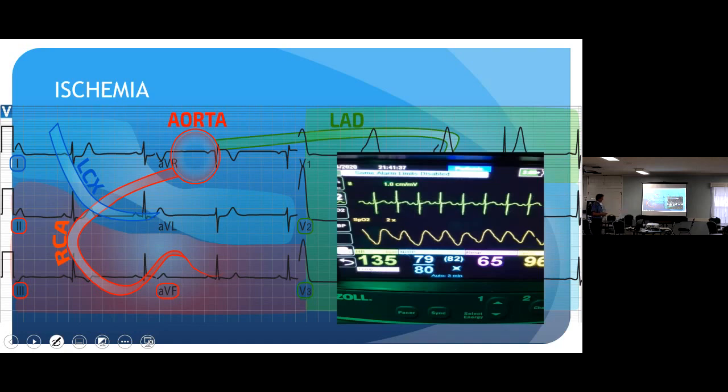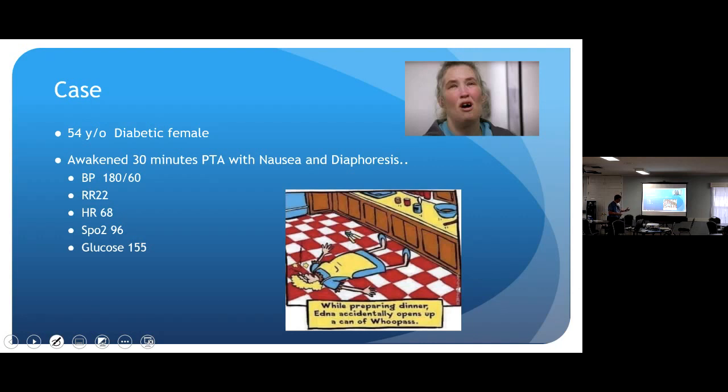So again, I recommend that you guys learn 12 leads, understand them, and can make a big difference in your patient, okay? Determine whether you stand on scene a long time, which hospital you go to, if you have a choice in hospital destination, but nothing else, it gives the hospital a pre-arrival notice that, hey, I got a STEMI, just get ready. That way we got our 30 minutes, 60 minutes to get them prepared to get to the cath lab.